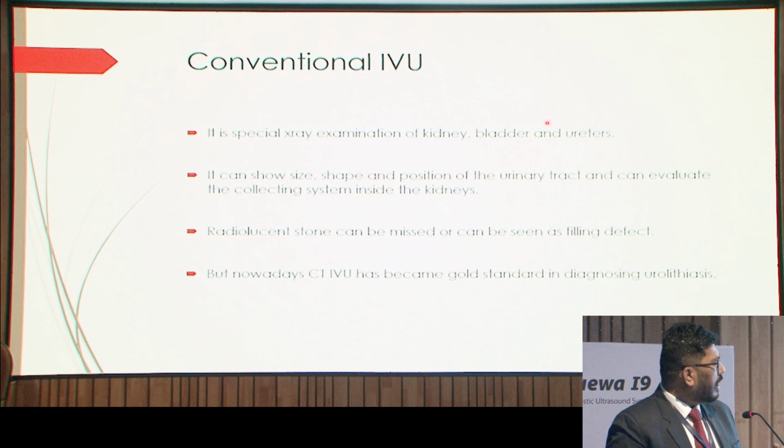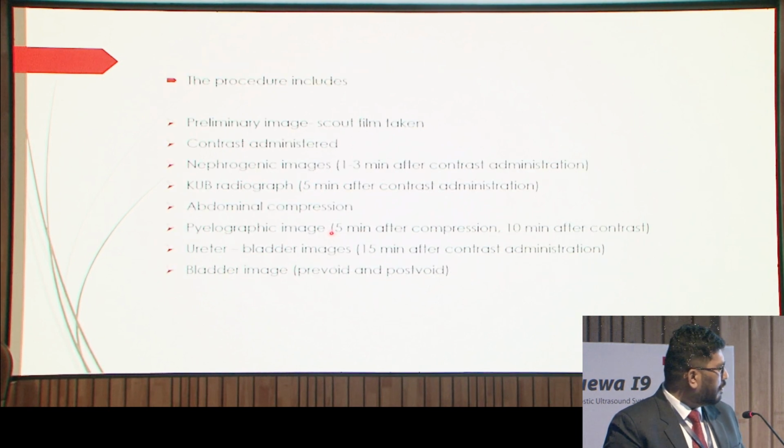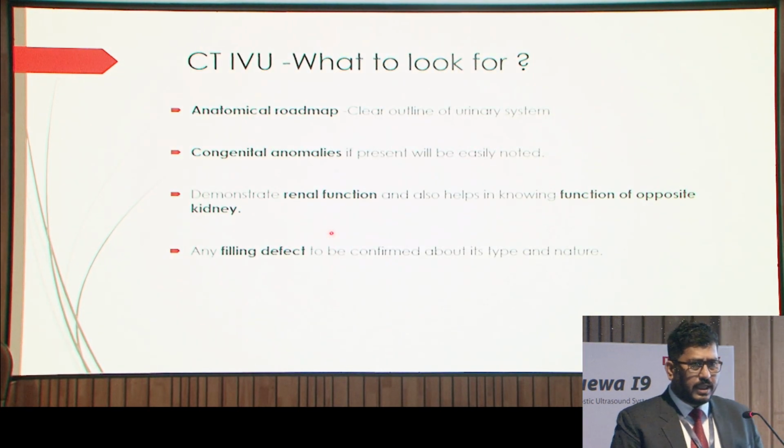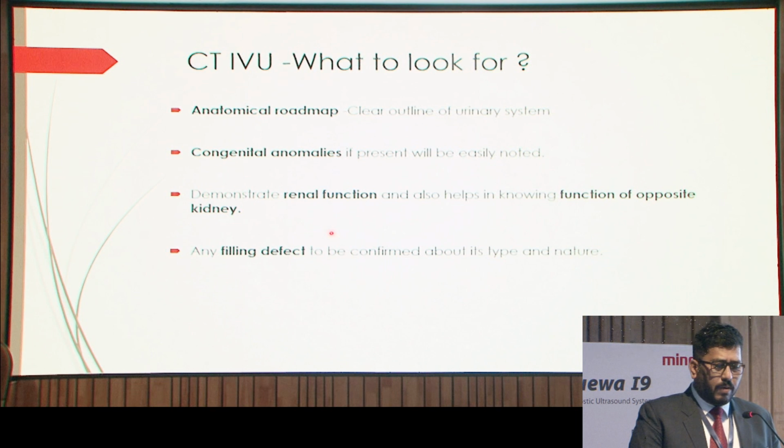Conventional IVU, I will not go into detail. It is a special X-ray which was done earlier, and nowadays CT IVU is the gold standard. This is the procedure, and this is how the conventional IVU looks. But coming to CT IVU, why CT IVU?